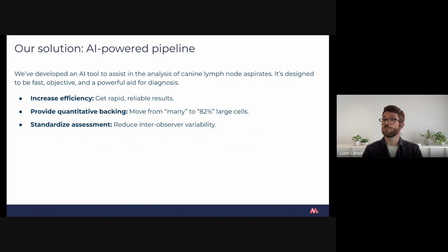And part of this is the real challenge of any of this AI and computational development, is translating the fuzzy requirements from pathology textbooks and from the pathologist's brain and create cold, hard, numerical, quantitative systems.